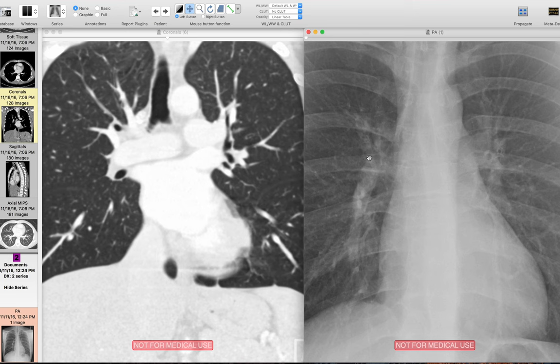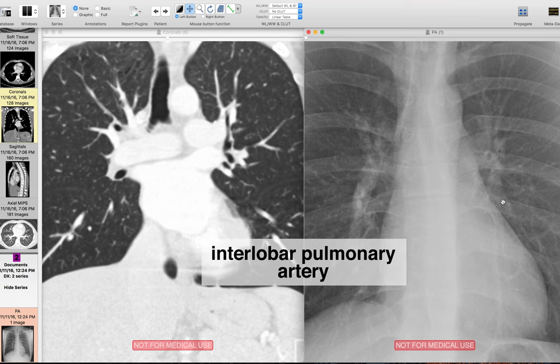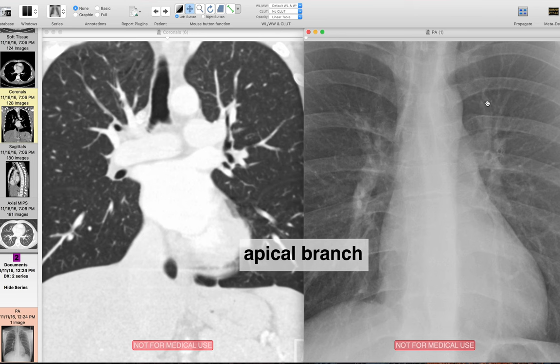Now let's take a look at the left hilum. The left hilum doesn't have that boomerang shape — I like to think of it as a hockey stick, where there's a large part that juts out and then a large part that goes down. That first large part that juts out makes up the majority of the opacity and is the left pulmonary artery. From the left pulmonary artery, the larger branch going down is the interlobar pulmonary artery, and the medial superior one going up is the apical branch of the upper lobe pulmonary artery.